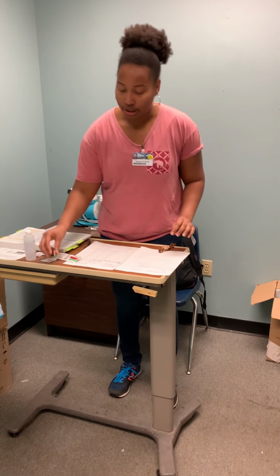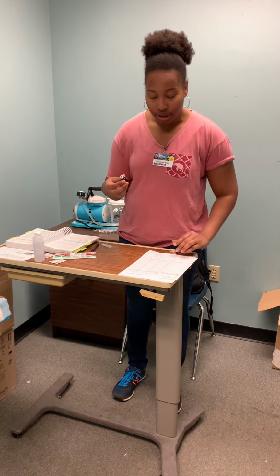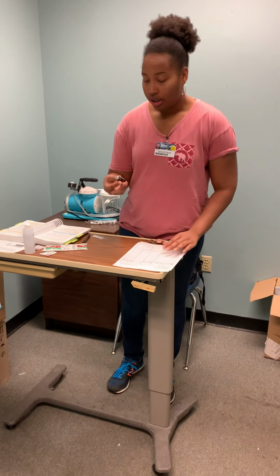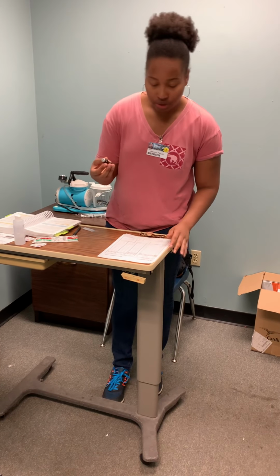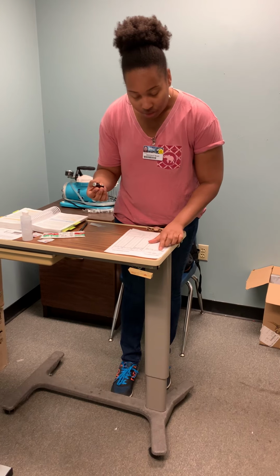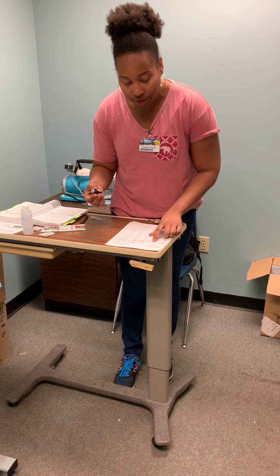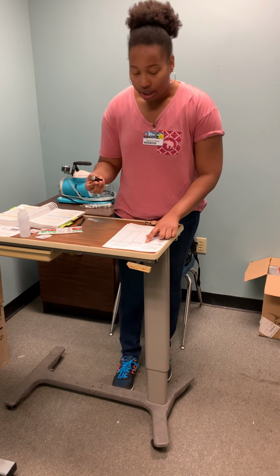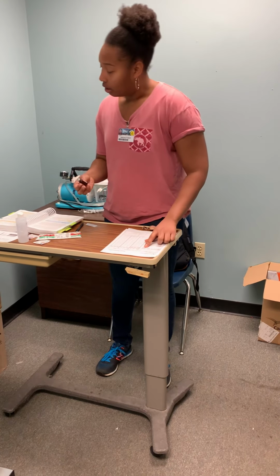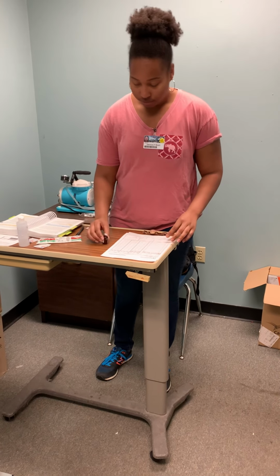Next, I'll take my medication, furosemide, and compare it to my MAR. This furosemide states that it's 40 milligrams per 4 milliliters. And the doctor order is furosemide 30 milligrams IV push every 8 hours. I've already done my math, so I'll be giving 3 milliliters of furosemide.